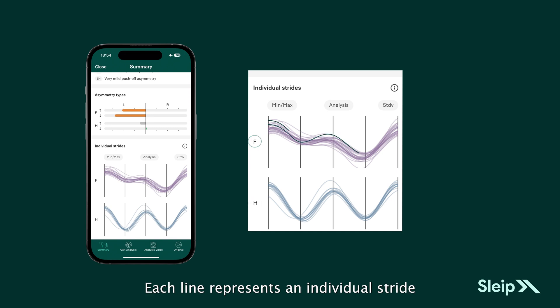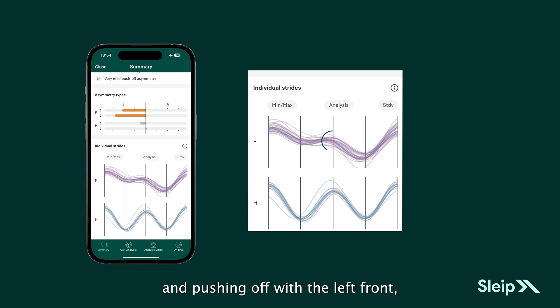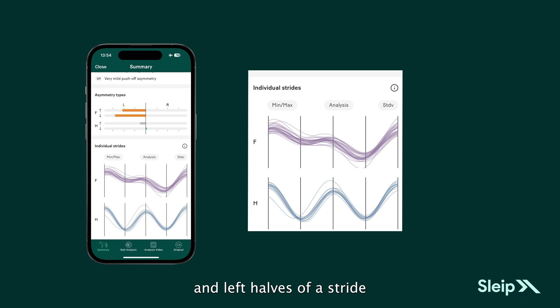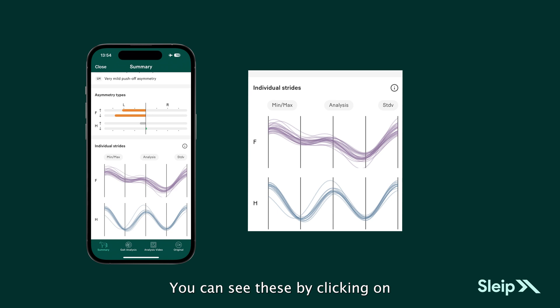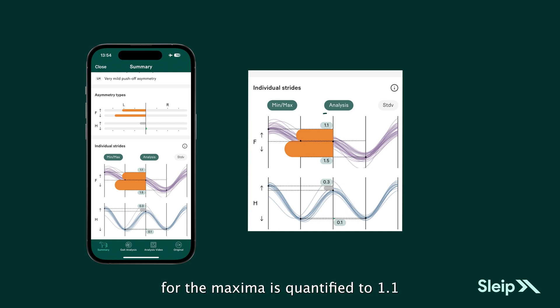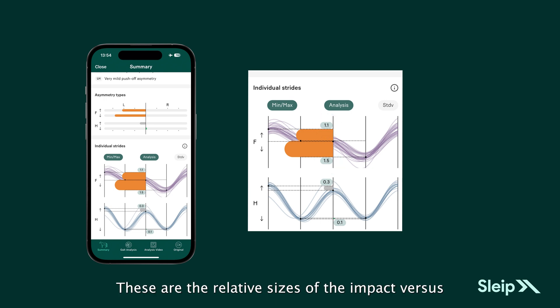Each line represents an individual stride and shows the vertical movements of the head and pelvis, starting with landing on the left front limb and pushing off with the left front, landing on the right front and pushing off with the right front. The differences in the maxima and minima in the vertical displacement of the right and left halves of a stride are calculated to quantify the asymmetry. You can see these by clicking on the min/max and analysis. In this example, the difference in the push-off for the maxima is quantified to 1.1, and the difference in the minima is quantified to 1.5 — these are the relative sizes of the impact versus push-off components of the asymmetry.